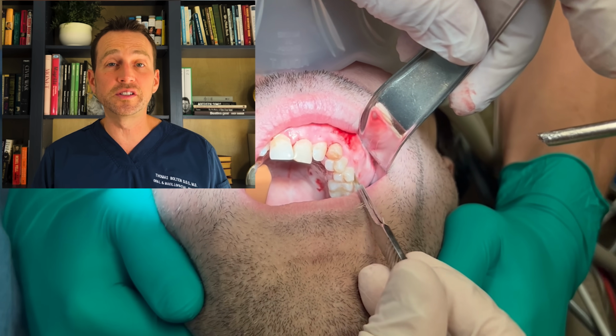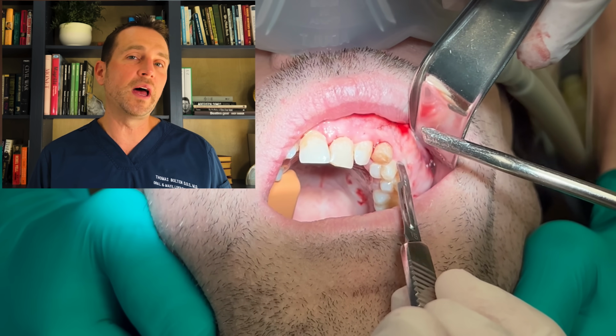Next, I make a sulcular incision and create vertical releases so I'm not fighting the soft tissue.